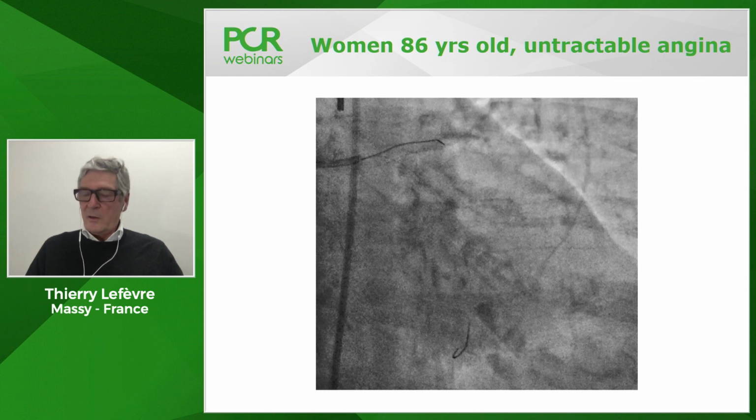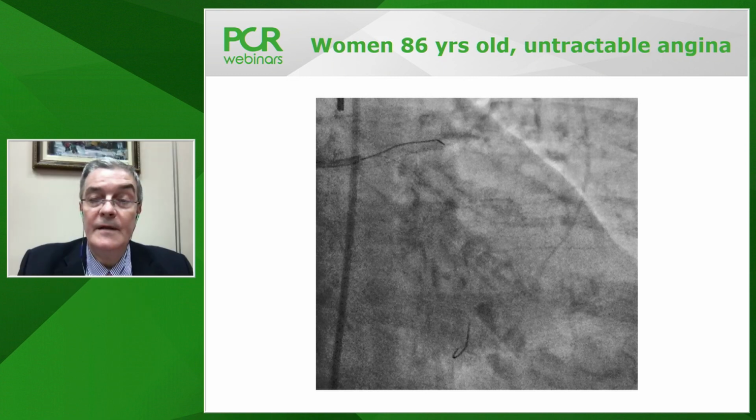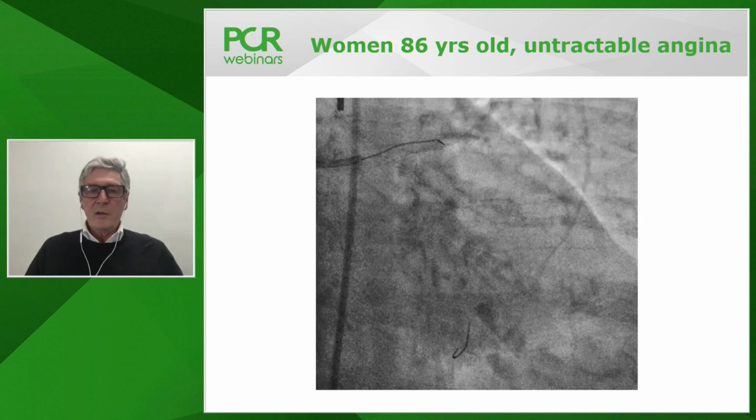Thierry, if I may add, in my opinion, I frequently use in this kind of anatomy a dual lumen catheter, having wired the circumflex, and then with the over-the-wire lumen of the dual lumen catheter, it's relatively easier, as another level of complexity. Absolutely. Please continue.